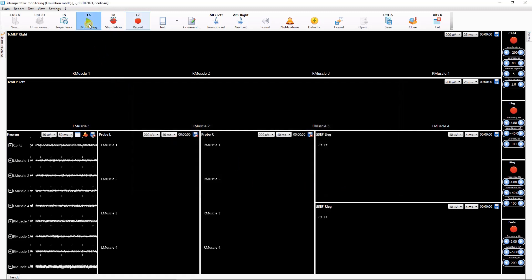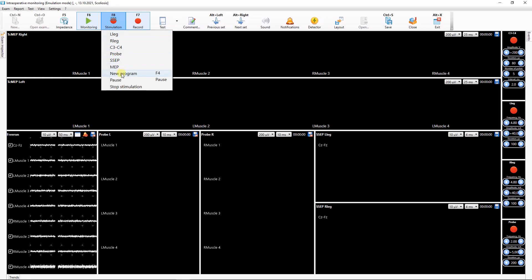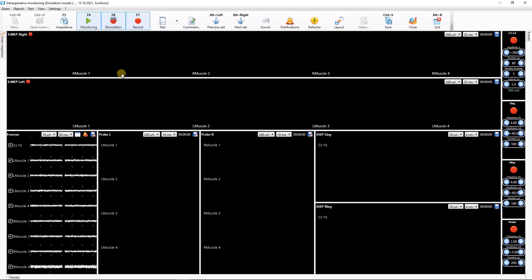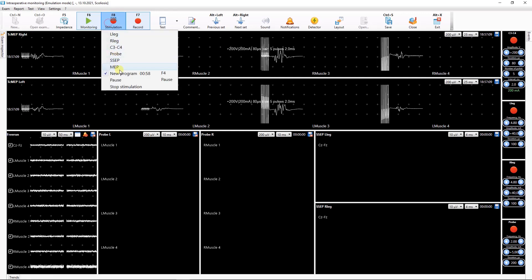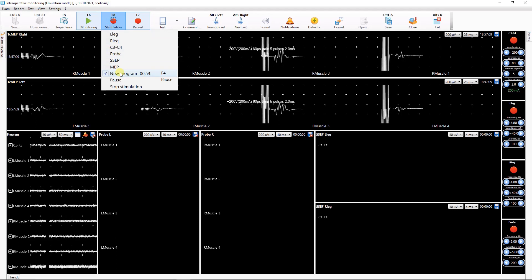Now you can select this program by clicking the Stimulation button on the toolbar and selecting the respective menu item using the hotkey. The enabled program will be marked in the list.